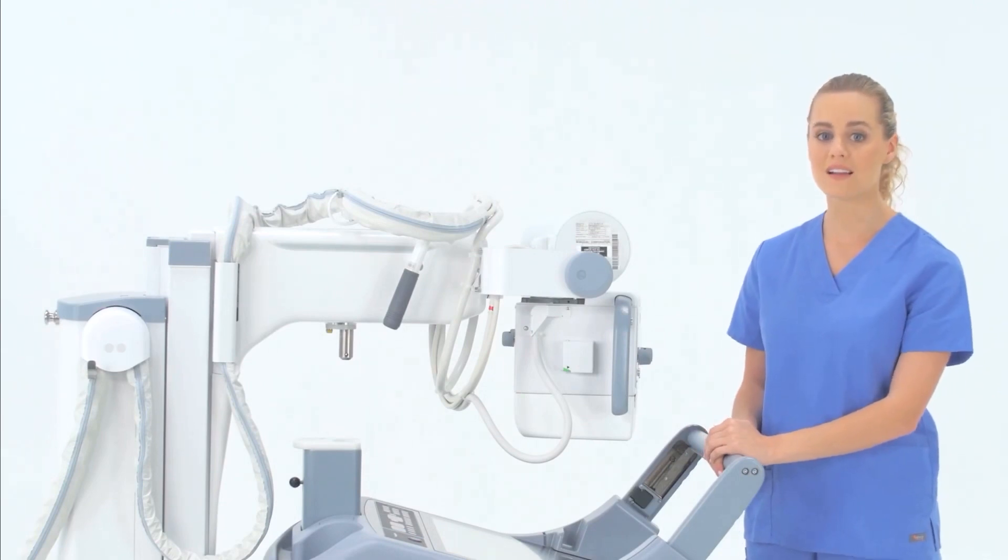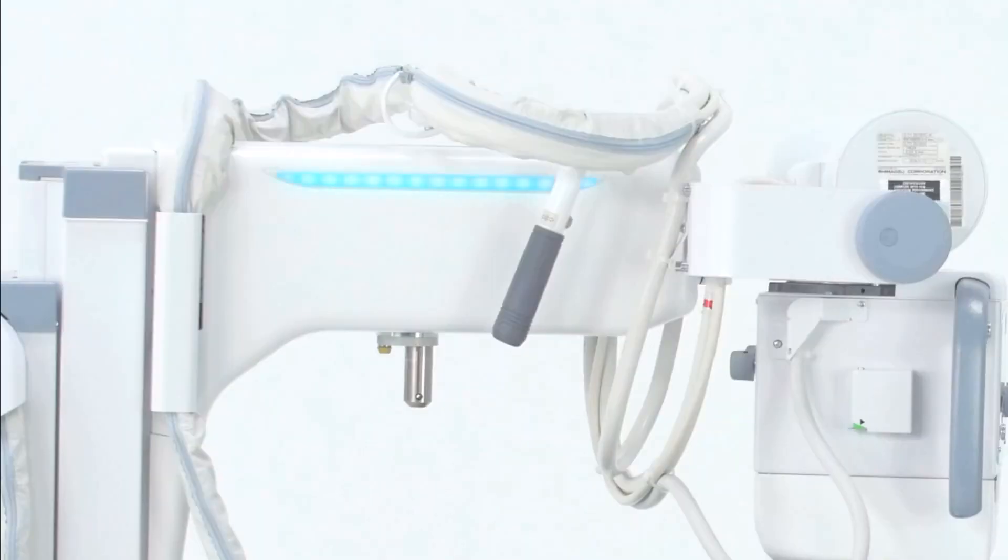When the collimator head is unlocked, the light on the side of the column will illuminate. The light will blink when the unit is charging.